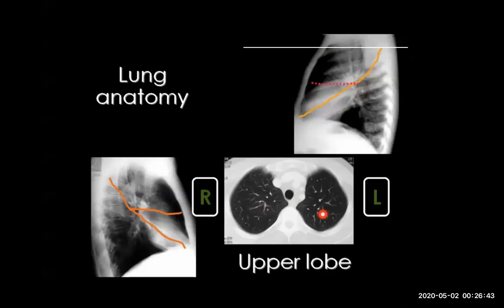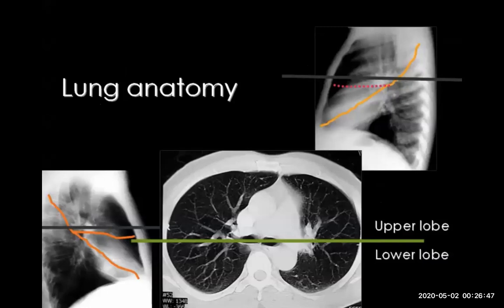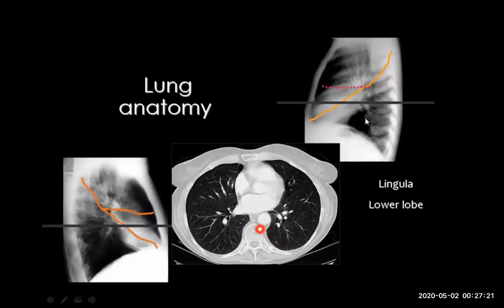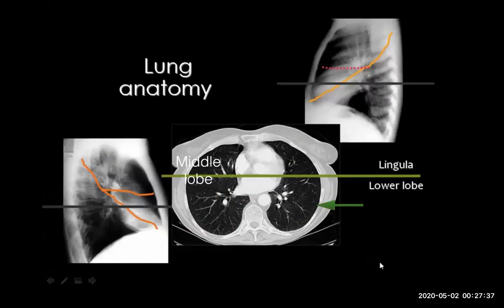This slice gives a line showing the right and left upper lobes. Going down, you will see the right and left main bronchi, meaning you are near the level of the minor fissure. Just behind an imaginary line, these are the lower lobes; anteriorly we have the middle lobe and lingula. Going further down below the transverse fissure, you will no longer see the bronchi, and here are the right and left lower lobes, lingula, and middle lobe.